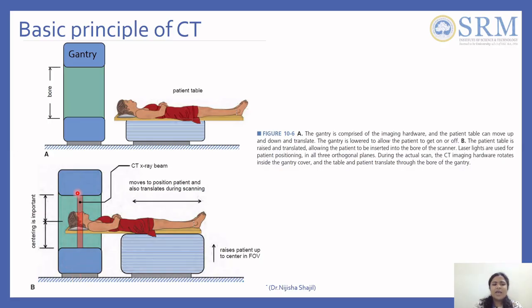Now at this point, all the additions we saw here, the attenuation coefficients output, are going to be taken and you're going to see it. It keeps rotating in such a way that you pick up this full slice. The main thing you have to understand is that this whole system has to move, and if I want to scan different areas, the patient has to move. So this is how it is done. Here they just want to show that you lie down, and the patient is raised up on the patient table, and you send it exactly into the center part of the gantry.